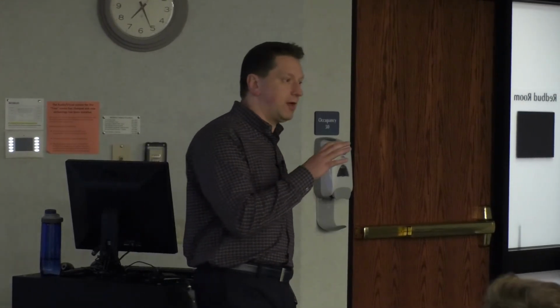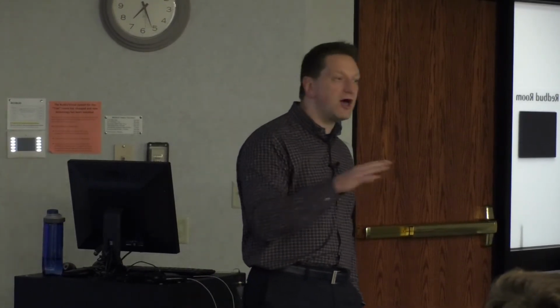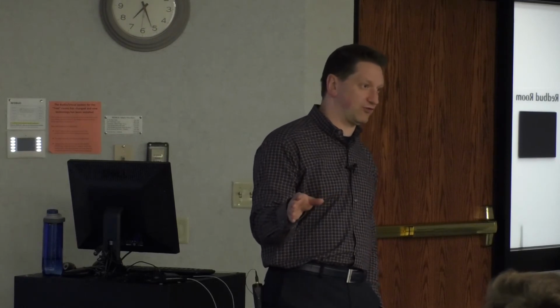Now, when I came to Cox, I was the only person that wanted to give high energy shocks. Okay? I know a few things that are not common knowledge. The reason 200 joules was set as the defibrillation energy is because 200 joules was all the original biphasic defibrillators could do. It was the max energy for those defibrillators, okay? They go to 360 now across almost all of the vendors, all right? Number 2, I know that you cannot injure a heart with defibrillation unless you create something called electroporation, and none of these defibrillators are powerful enough to create electroporation.